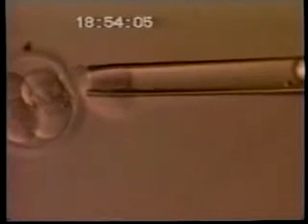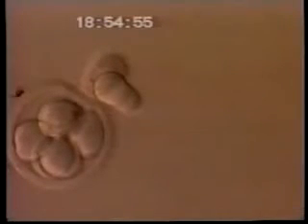Now we can remove another cell, converting this from a day 3 8-cell embryo into a day 3 6-cell embryo, and this will in no way damage the ability of that embryo to develop into a normal baby. Yet we will have 2 cells that we can genetically analyze so as to determine whether or not this would result in a baby that has a severe and lethal genetic disease. You can see now that the second blastomere is being very, very gently teased out of the zona pellucida, that is the outer shell of this embryo, and we now have successfully biopsied this embryo, removing 2 cells that can be tested and leaving an intact 6-cell embryo.